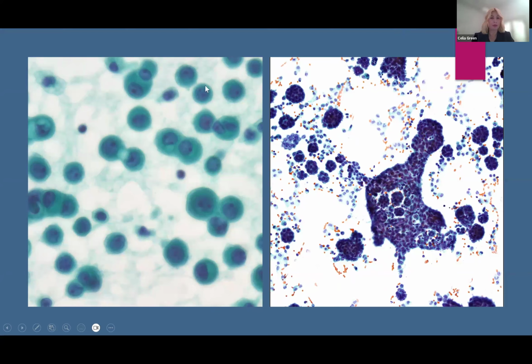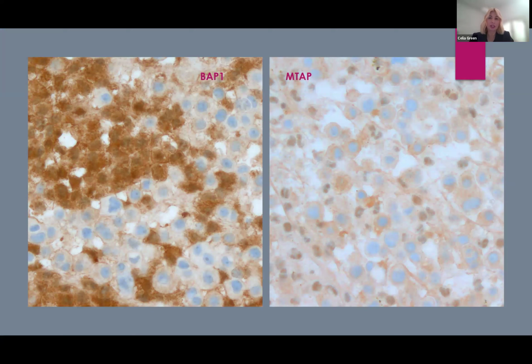But if you get this one, you're going to get someone who's hedging their bets and then going to need another couple of days. So the advent of these immunohistochemical stains has been very helpful. We've been doing cytology for malignant mesothelioma for 30 years in WA, but this should allow more and more laboratories to come on board cytologically.